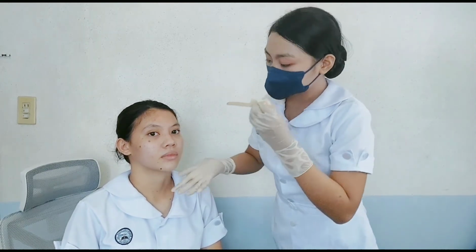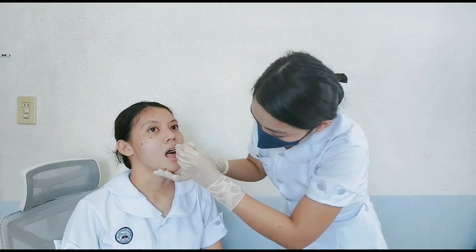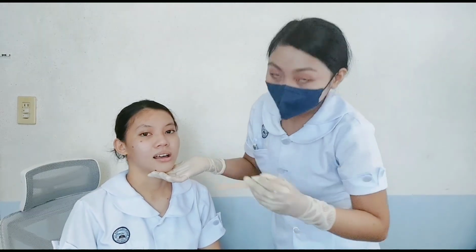Inspect the tonsils for color, discharge, and size. Elicit the gag reflex by pressing the posterior tongue with a tongue depressor. So after the procedure, we can now document the findings in the client's record.